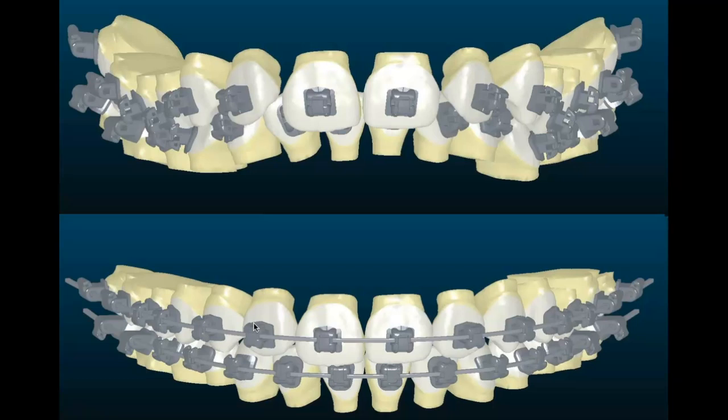Now, this system was actually really, really good in theory. In addition to placing the brackets in the right spot, this system would actually calculate and create custom torques and custom bases. They would have a bracket base, this part of the pad right here, the flat part that touches the tooth. Those were separate pieces, a piece for every single tooth, and then the bracket part of it that was here, they would laser weld onto that base at the specific torque that was needed for that tooth.